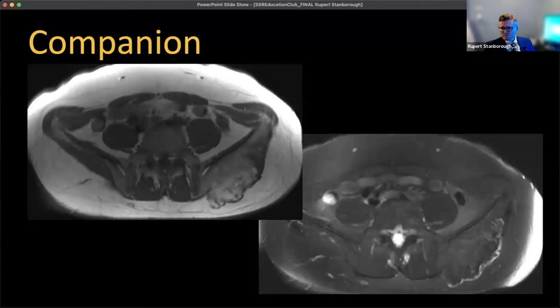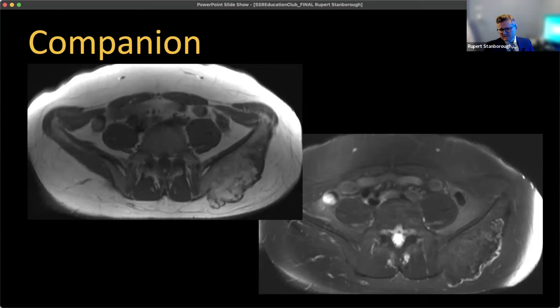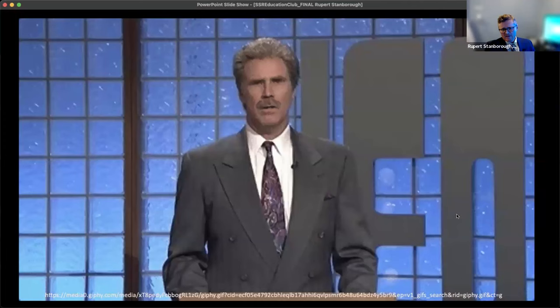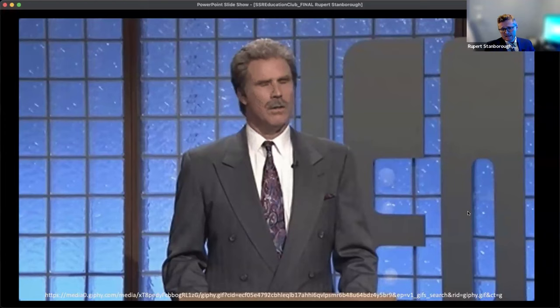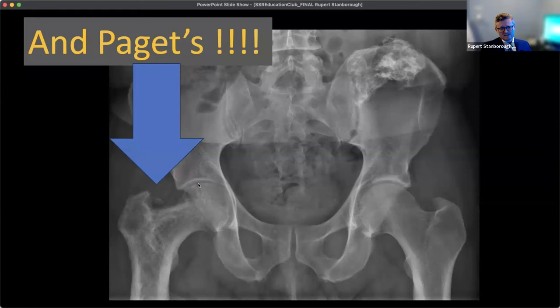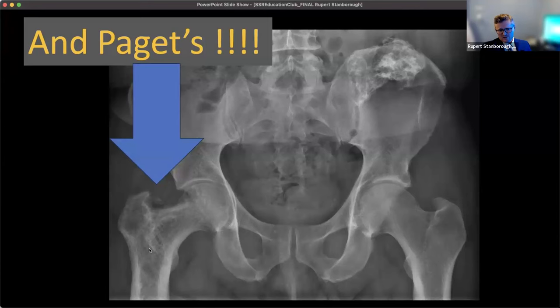The difference between this osteochondroma and the one that transformed into secondary chondrosarcoma is that this one's sessile — the base is wider where it attaches to the bone, whereas the pedunculated cases almost look like a mushroom. This case also had a daily double: Paget's disease. We've got that stereotypical cortical thickening, marrow expansion, and trabecular coarsening — slam dunk Paget's disease for this patient.